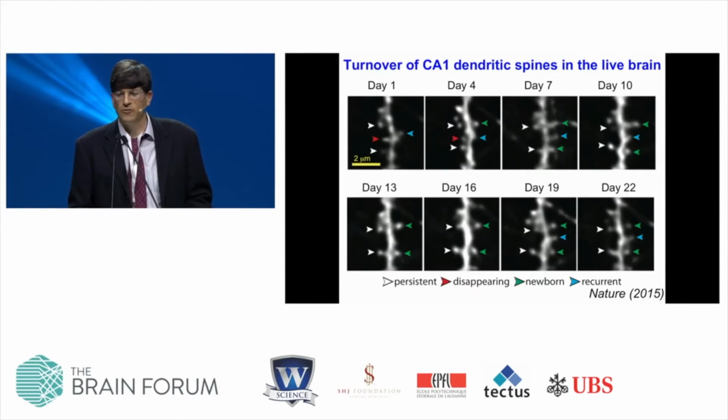By choosing the appropriate microendoscope with diffraction limited resolution, we can even resolve the individual synapses of these cells, seen here by way of their postsynaptic morphological entities, the dendritic spines. And we can track these individual synaptic elements over weeks, as seen here in this 3-week experiment. Some of the spines persist throughout, others arise midway through the experiment, and still others disappear midway.